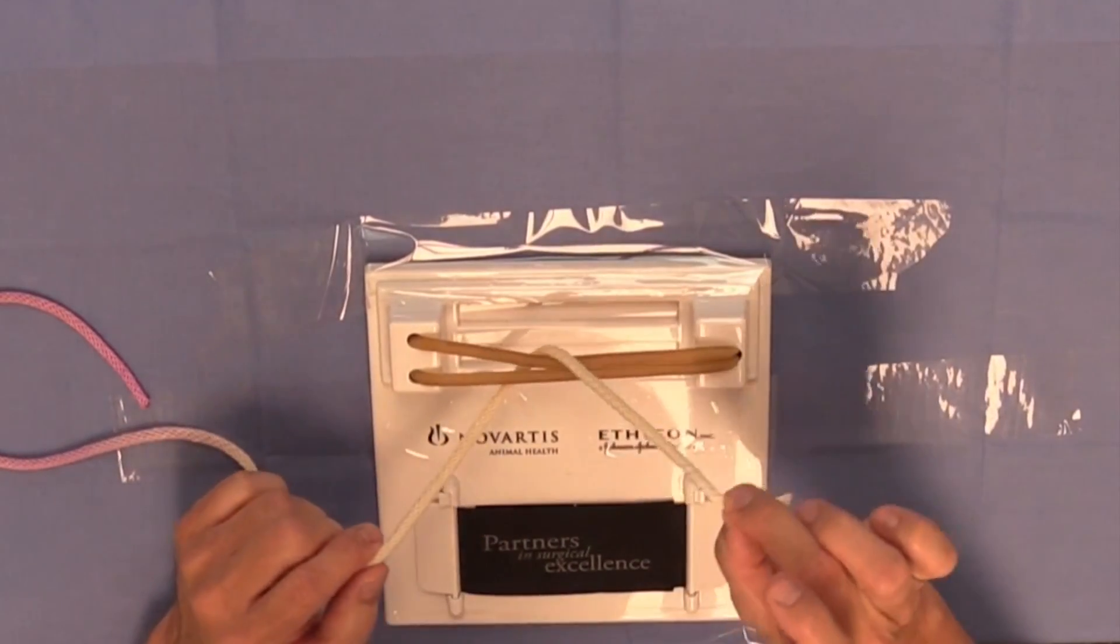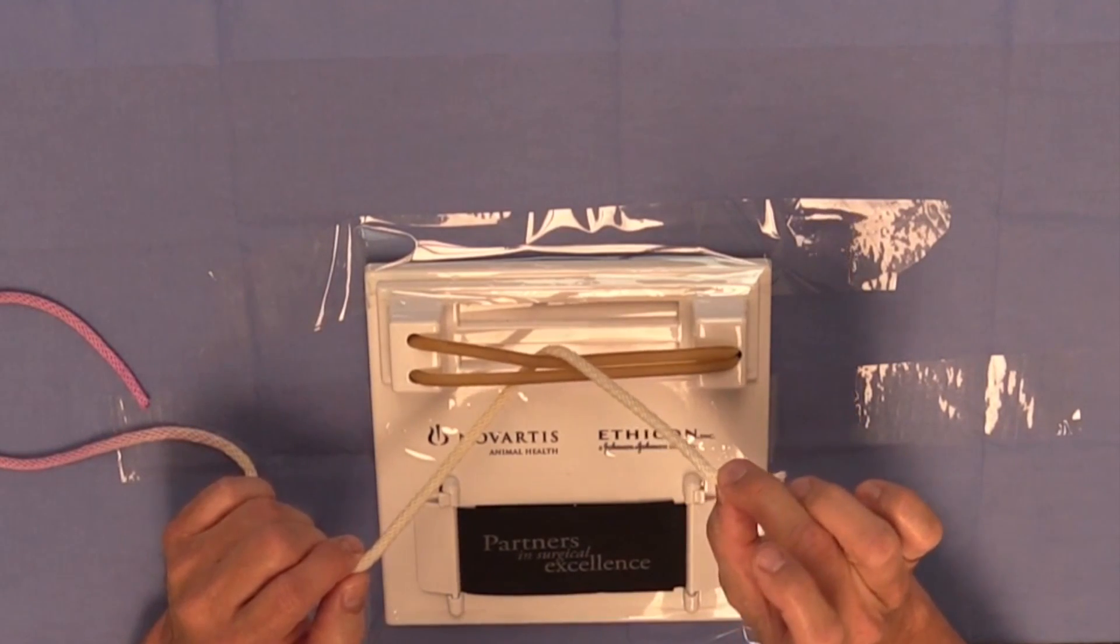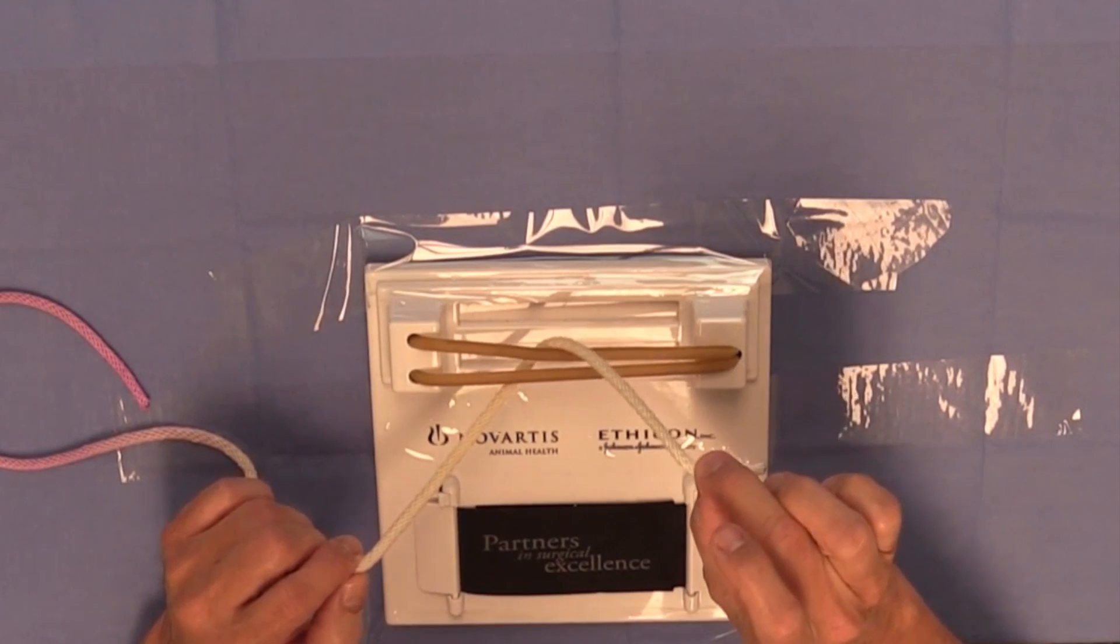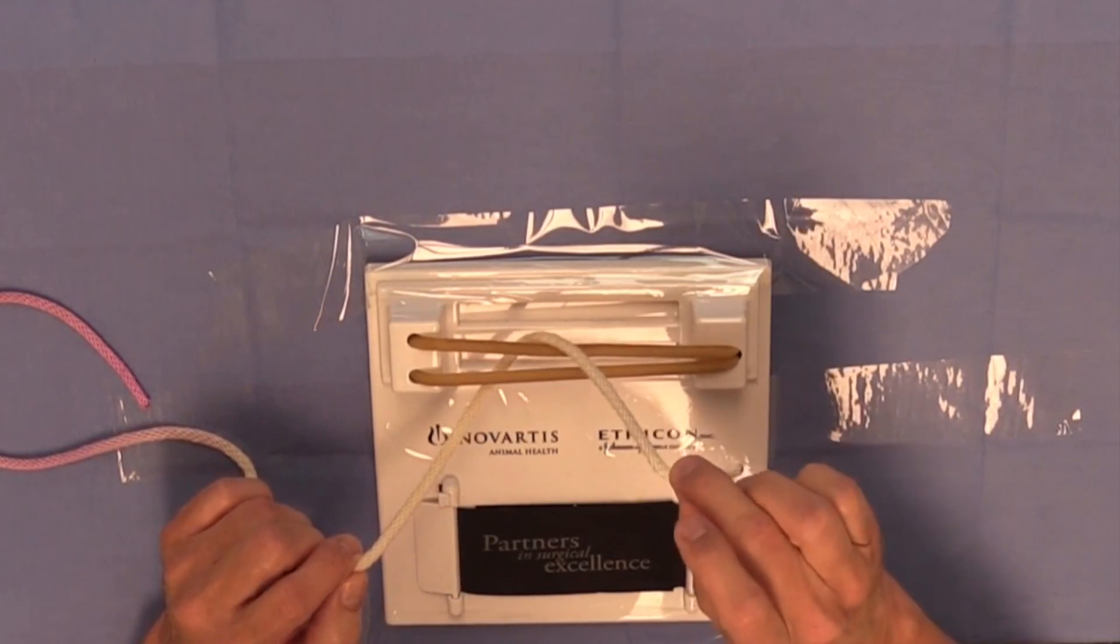Now, I have the short end of the suture material between my thumb and middle finger in my right hand, so I'm going to construct this knot using a one-hand technique, leading or using my right hand.